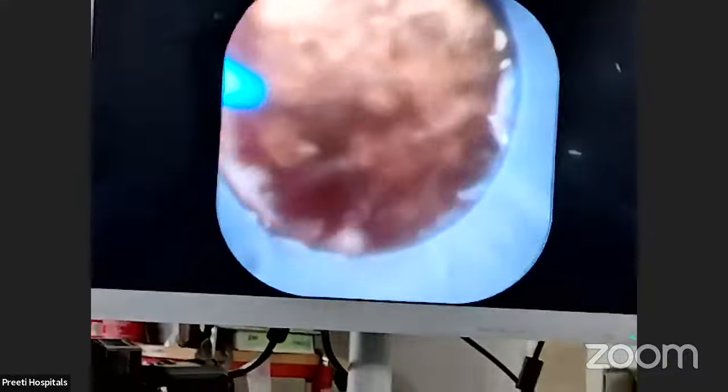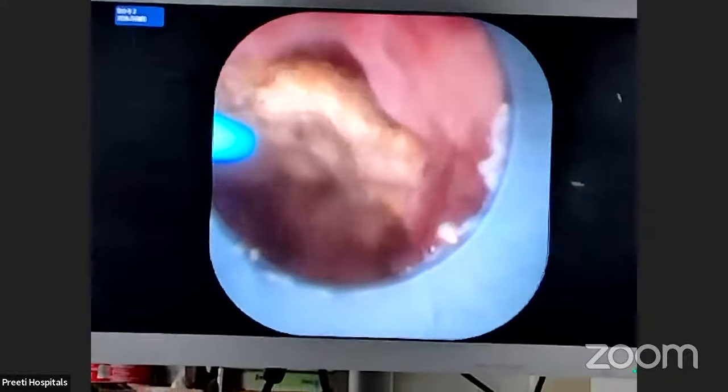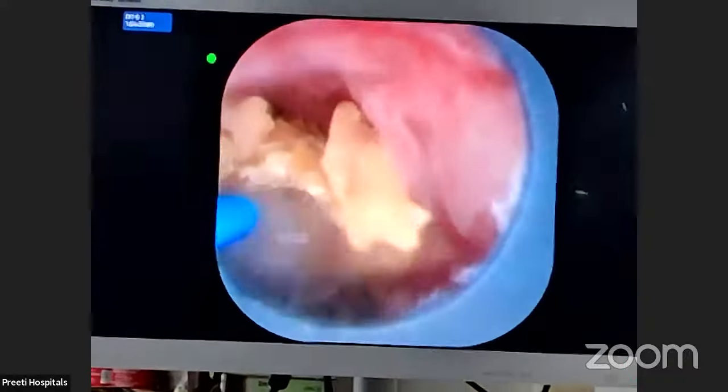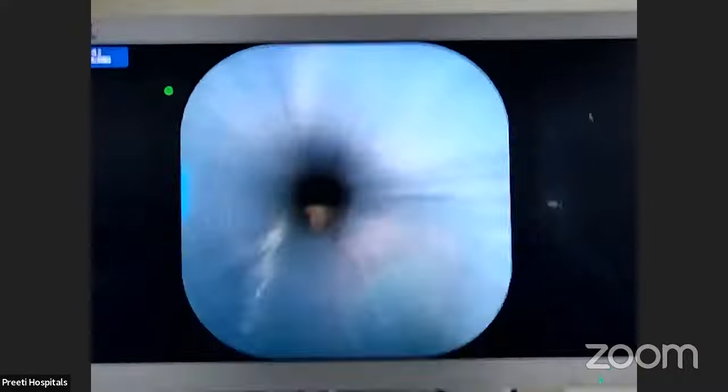Now see how the powder is sucked out spontaneously, how the kidney stone is also dropping down. Are you observing? Yes. So now keep on doing it. And in the end, we will not have a single fragment inside. See, these fragments are telling that they want to go out. You let them go out.